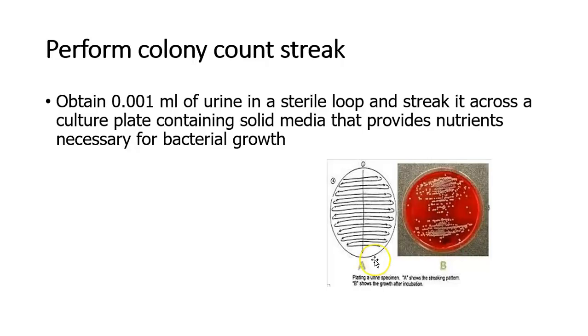And then you would inoculate the rest of the plates, put it in the incubator, and the next day you look at it. If the colony count is small, that's usually not indicative of a UTI. Sometimes it can be. If it's coming from a sterile area, like we have gotten taps of newborns, and if you get a tap of the bladder, if anything grows, we're going to report it out. But urines can be interesting because, particularly in females, you can get a lot of vaginal contamination if they don't clean themselves well when they collect the specimen.